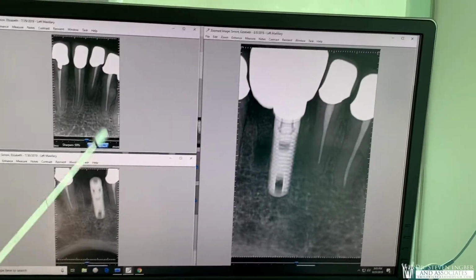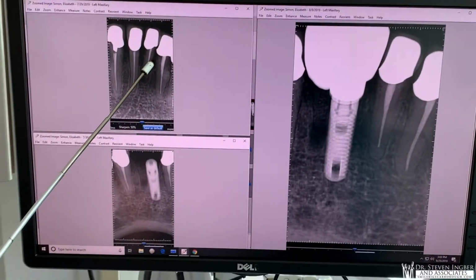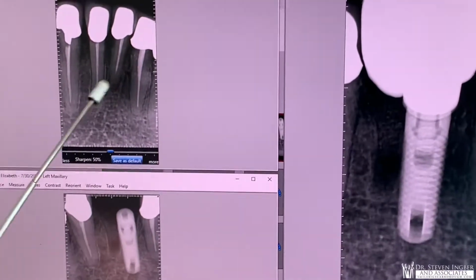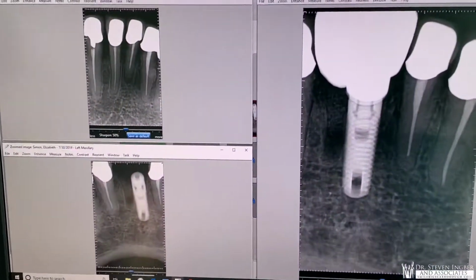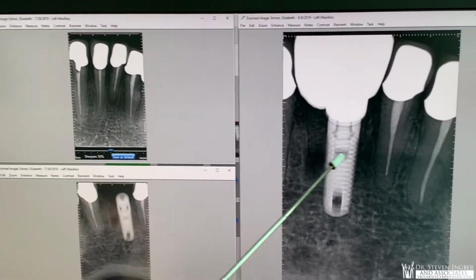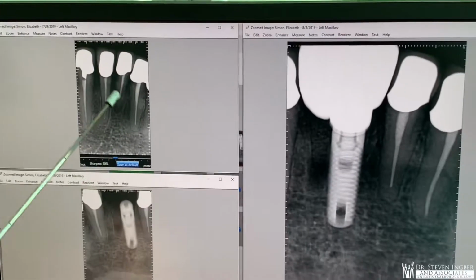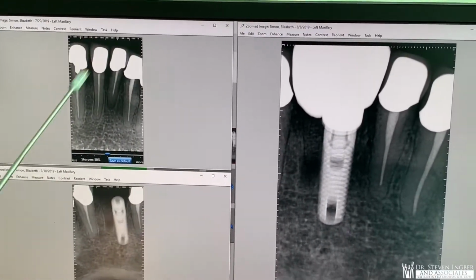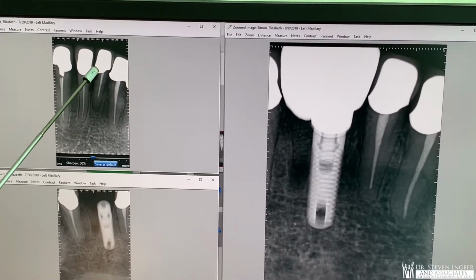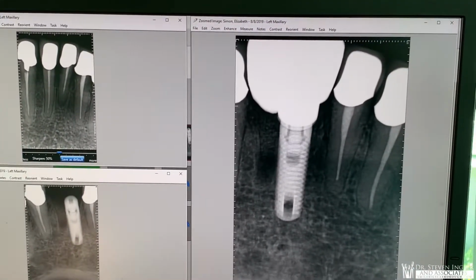So we had one appointment. What happened is the first appointment is that this tooth was hurting and it failed, this root here. So this is what I said to her. What we're going to do is we're going to take out some teeth, and we're going to take out the tooth right in there, right? When we took out the tooth, we realized that we had the space. Now we can put in some nicer looking teeth. So instead of having fatter looking teeth, we could put in nicer looking teeth in the space when we took out this tooth. And what did we do? We took out the tooth, one tooth, right? And then we put in 2 teeth on top of one implant, which is right there.